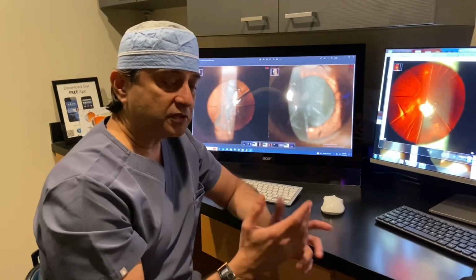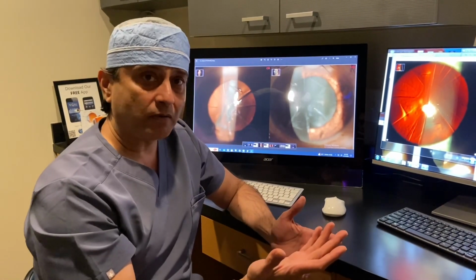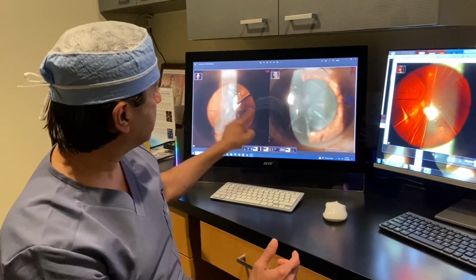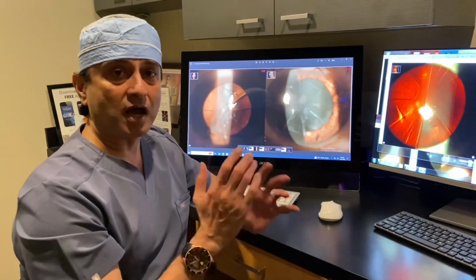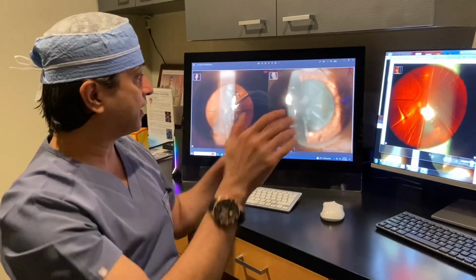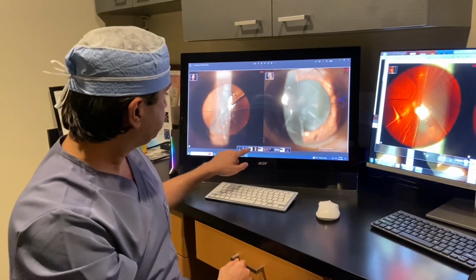This again points to what I say. Even though I've done patients with 44 cut RK cataracts, here's a patient with 8 cuts, but see the way the cuts are done with the astigmatic cut. 16 diopter irregular astigmatism. The whole cornea is like ectasia. I have to do cataract through that.